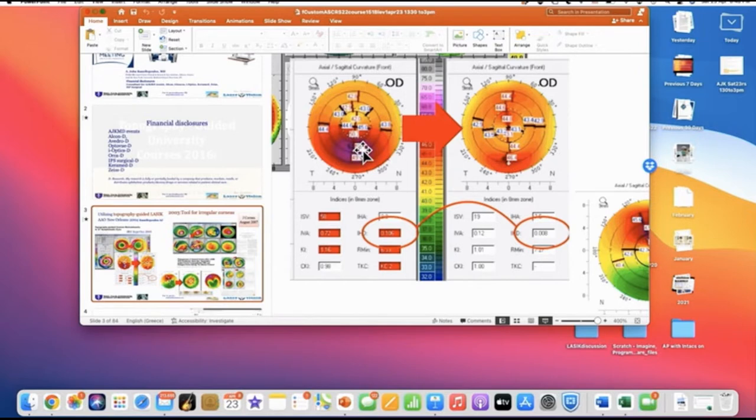Of course, you can retreat, and this cornea, even if this cornea has a refractive error, it's a very simple spherical, usually, correction. You don't have a lot to play with here. You have a normal cornea. Let's say you have to treat the -1.5 or +2. You just do a hyperopic correction centered on the vertex.